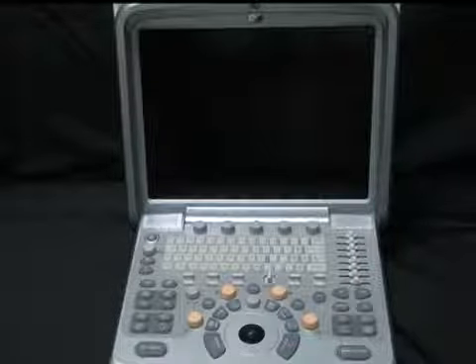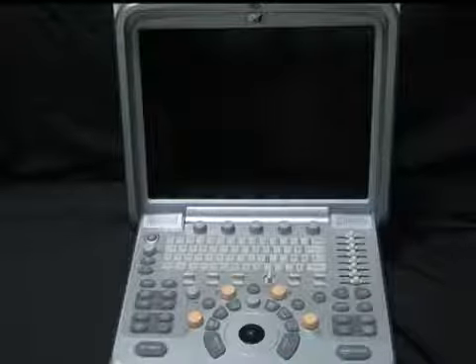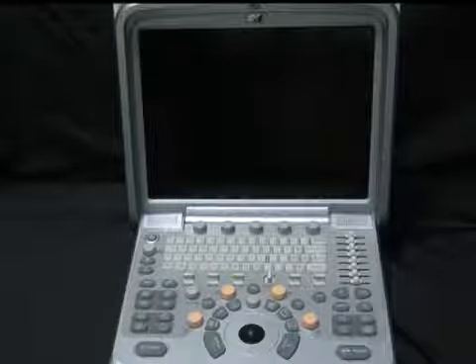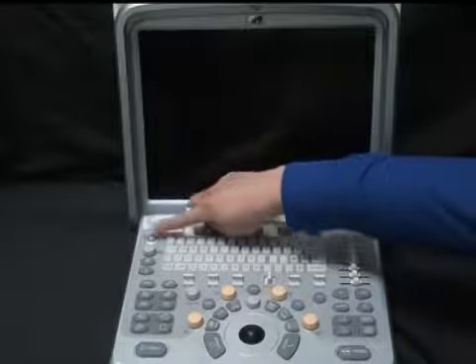Now we are going to give you an operation training. Part 1. Start the system. To get started with the Chison Q9, press the power button located in the upper left-hand side. Hold it down until you hear it begin.